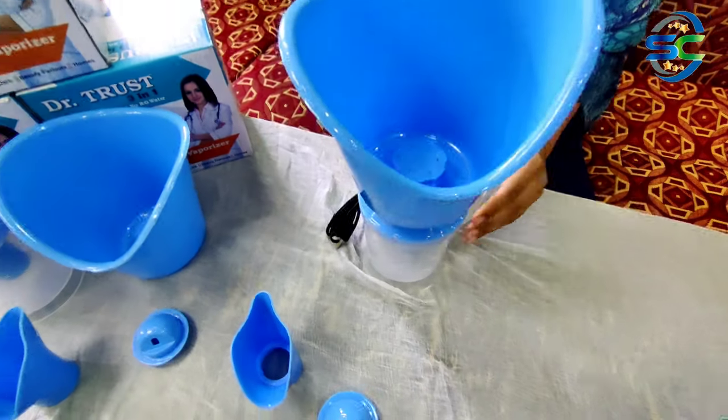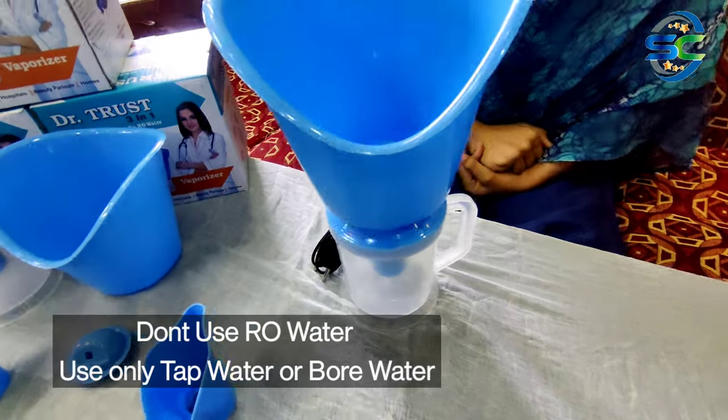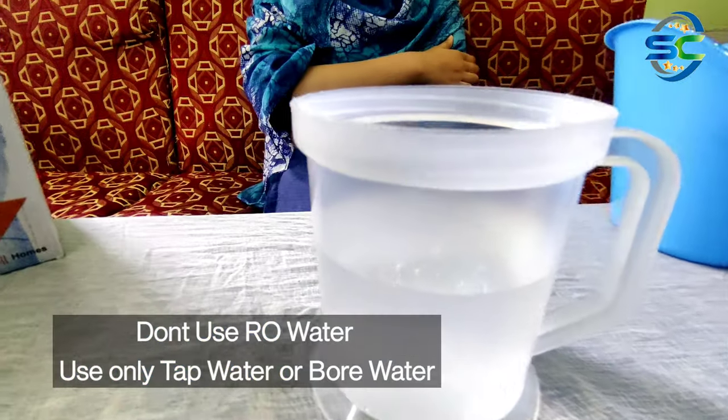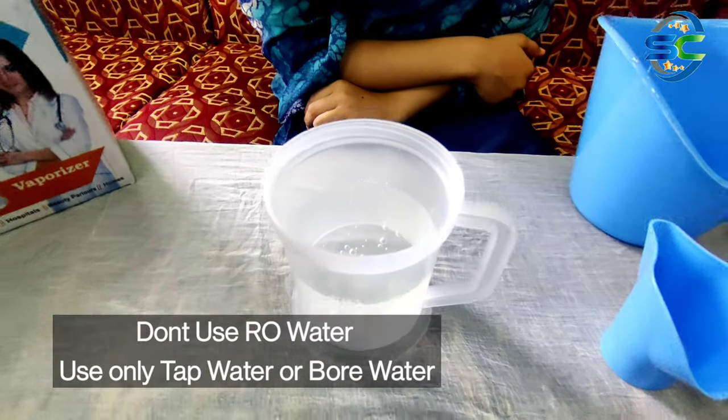Before we add water, remember to add water to the correct side. Without water, adding power will cause damage to the part — the part will be damaged.